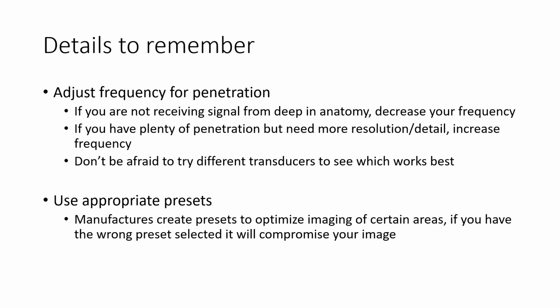The other thing is we get in the habit of using certain transducers for certain exams, but sometimes you want to make sure that you're not afraid to switch transducers. If you have a really large patient, you may usually use a linear probe that has a high frequency range to assess a certain vessel, but you're struggling because the patient is large. Don't be afraid to try a curvilinear at a lower frequency, because that can really prevent a lot of frustration from the inability to penetrate the tissue. So always be willing to adjust probes, adjust frequency.